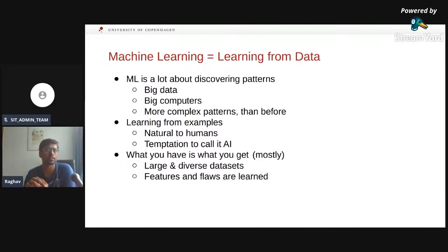And this is a constant problem in making machine learning models generalize. The core issue in machine learning is generalization, where the model should do well on data that it has not been trained on. Meaning, like I said, if you've trained a model in the US, you want the model to work in India. And if it works well, then that's a good model. The whole hunt in machine learning is to come up with good models which are generalizable.